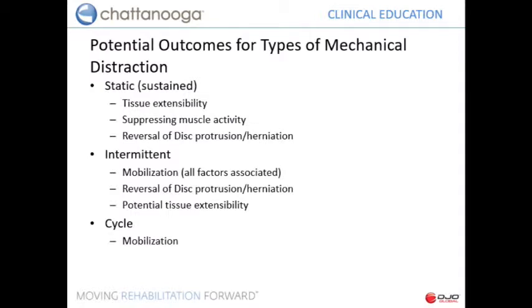So if you need to improve mobility because of degeneration, or because there's edema in the area and you want to influence the lymphatic return, or I love using it for mobilization of the neural tissue, which is a great opportunity to do things that might otherwise be rather difficult. Same thing, reversal of a disc protrusion, especially when you're using a gradient where it's only about 30%.